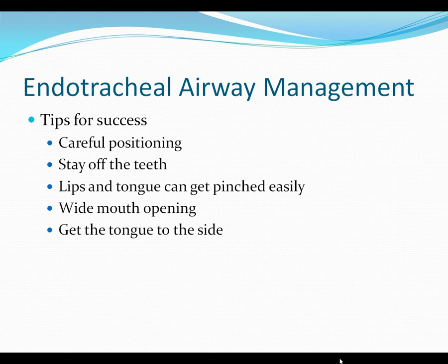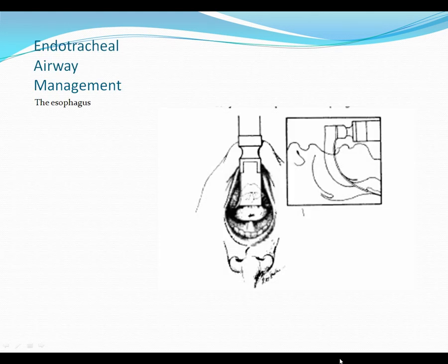Has anyone seen that? That's the esophagus. So it just looks like a round, dark hole. You don't see any sort of cords or arytenoids or anything like that.